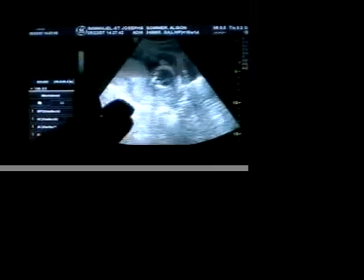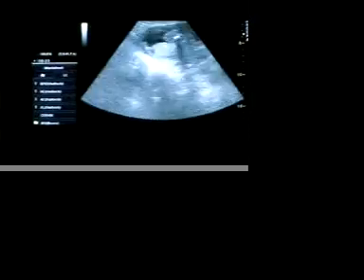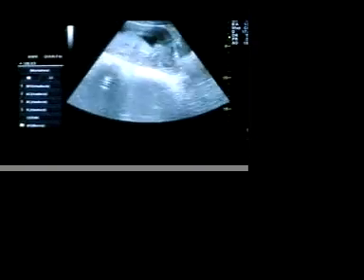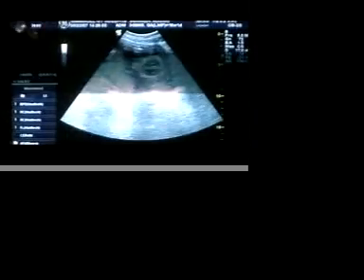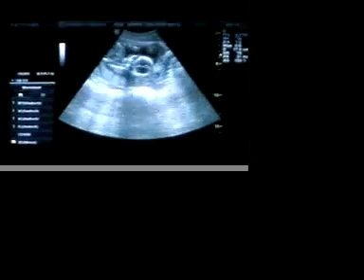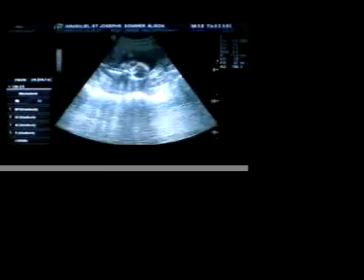You see the hands right by the head? That's the lower bone of the arm, and that's kind of a fist. All those little dots are the digits on the hand. Not willing to show us the face either. That's not very fair. You were wiggling all around and showing us everything a couple weeks ago, baby. Is that arm again up by the head? Can you get a sense of baby's face here? You can see the eye, this is forehead, this is the lower part of the face.